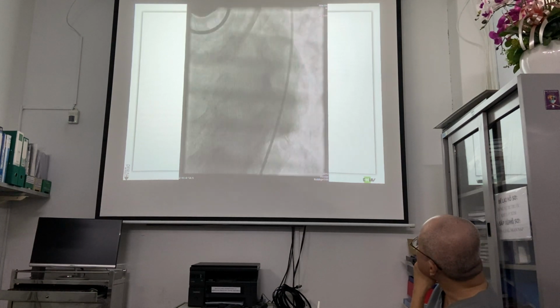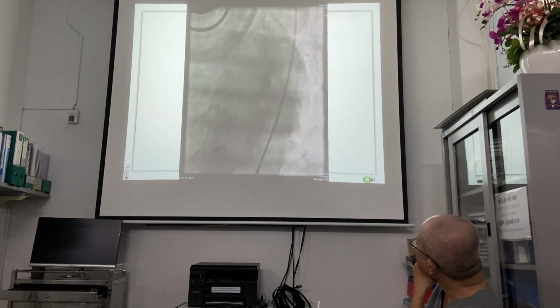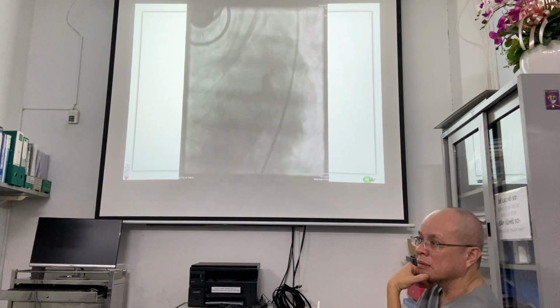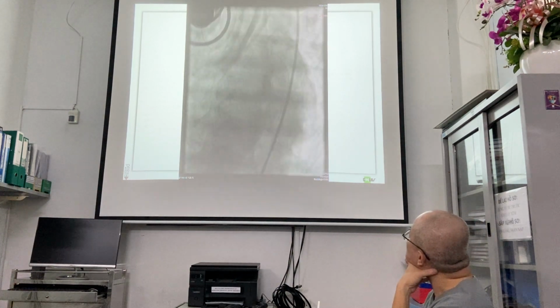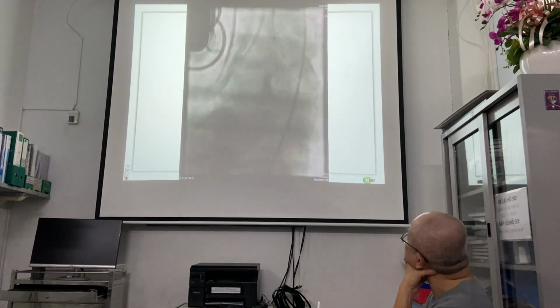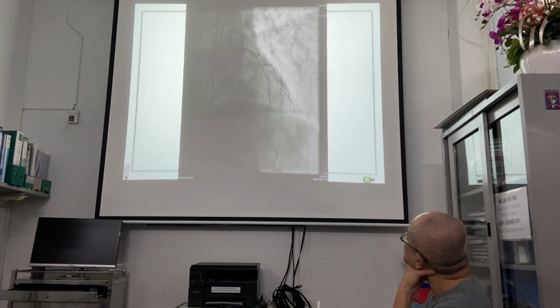No, this is the Lucas that is working. The Lucas is working, but if you look at this, there is no heart activity. We also did an echo, and the heart is completely not moving at all. And look, this is after a while. What do you see?